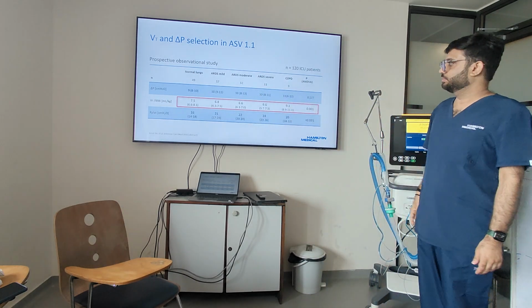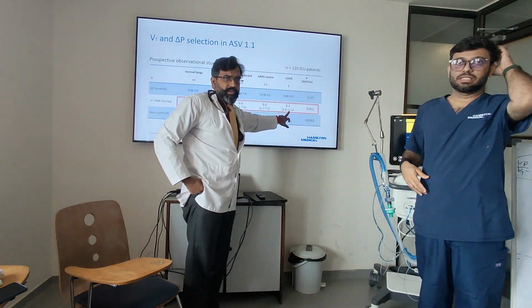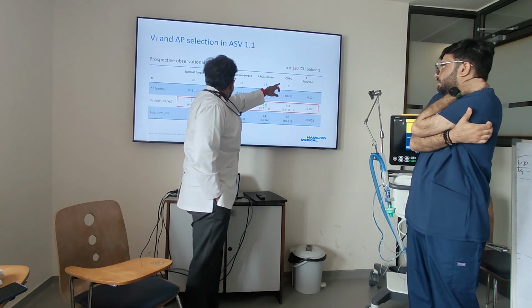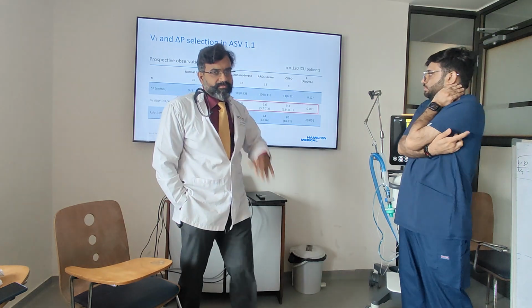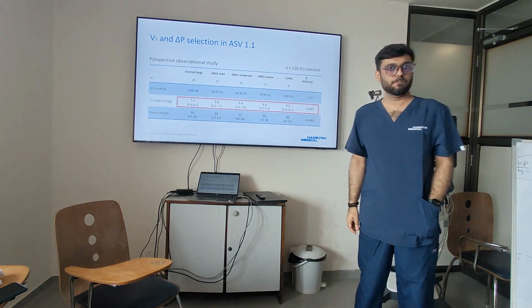So you got that answer. Even if the tidal volume goes up to almost 11 ml a kilogram, your driving pressure and your plateau still remain safe. So it answers the big question, what will happen with 1000 ml? It's not going to happen.